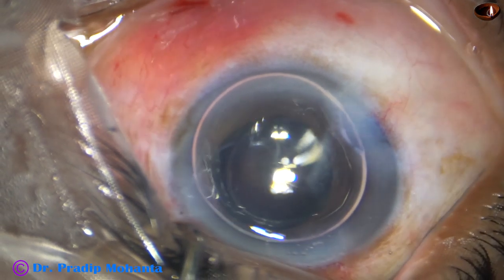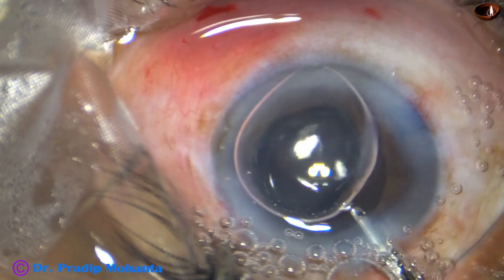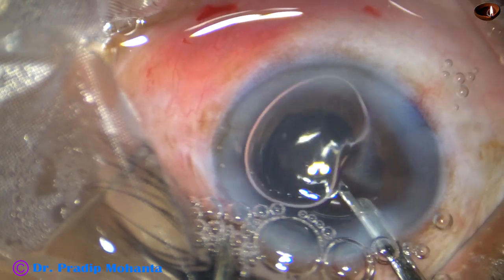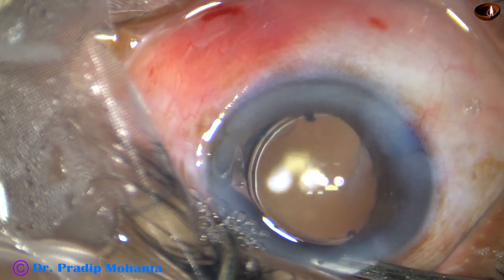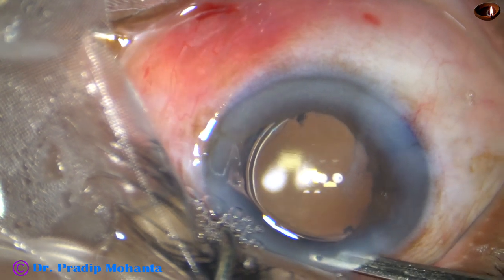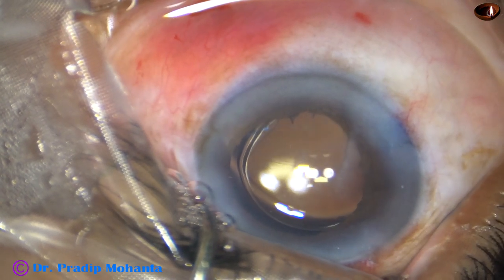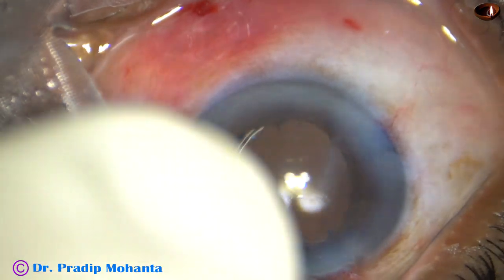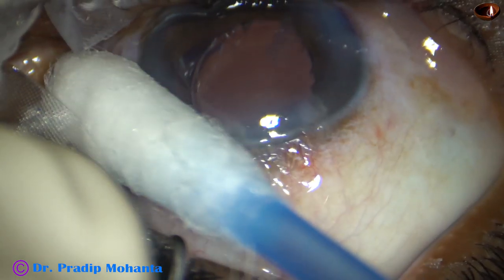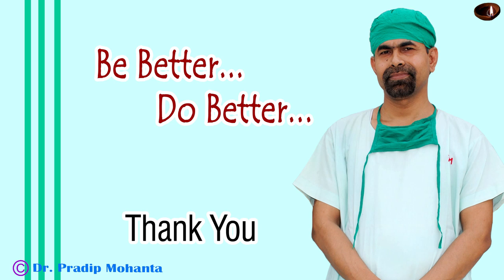This is closure of the side ports. Now this is the final lavage of the anterior chamber — the anterior chamber is lavaged very nicely and pure BSS is left in the anterior chamber. The anterior chamber is very nicely formed. Integrity of the wounds is checked by a cotton-tipped applicator, and then the case is concluded. Thank you very much for your attention. Hope this video will help you in developing your surgical skills. Be a great surgeon and serve your patients with love, respect, empathy, and great surgical competence.